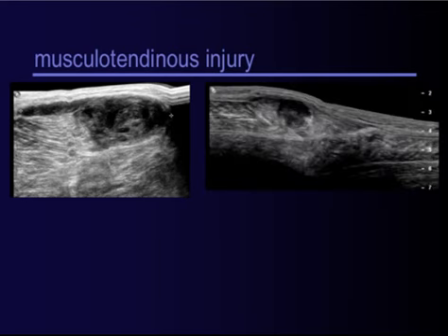On this panoramic view, we again see this is the medial head of the gastrocnemius, which is interrupted with a large hematoma in that area of interruption. And deep to this is the soleus muscle. This represents a tear of the medial head of the gastrocnemius, which is actually not that uncommon and can present with calf pain, obviously, and present to the department for a DVT study.